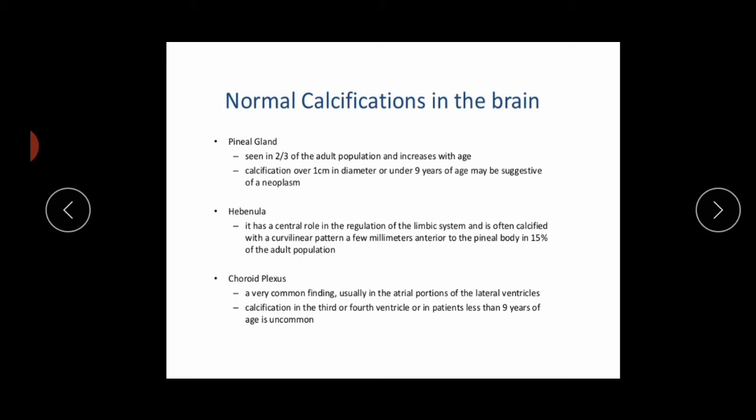The choroid plexus is a very common finding, usually in the atrial portion of the lateral ventricle. Calcifications in the third or fourth ventricle or in patients less than nine years of age is uncommon.